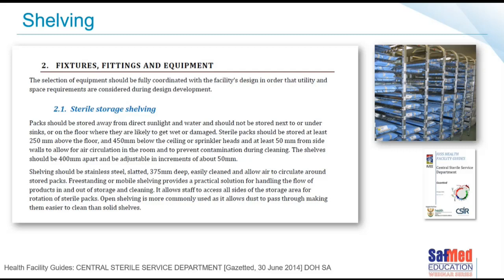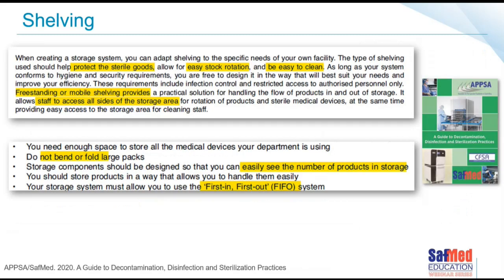So how do we actually dust these areas? Another important point. If we've got slotted shelving, how are we going to dust them? Do you dust them? How often do you dust them? Who does that dusting? Very important concept. Shelving. Does the shelving matter? Yes. Should it be a wooden box? No. Should it be made of wood? Not at all. It needs to be made of fixtures and materials that are easy to clean. Slotted, easy to clean shelving.